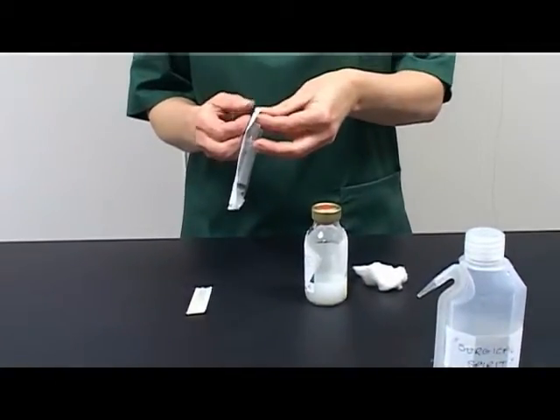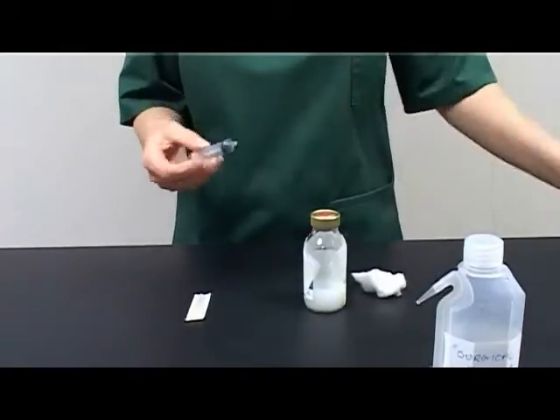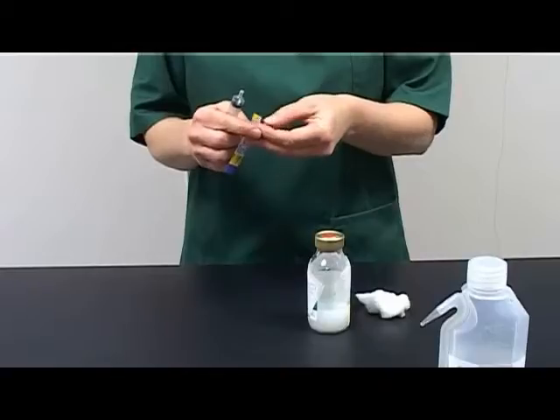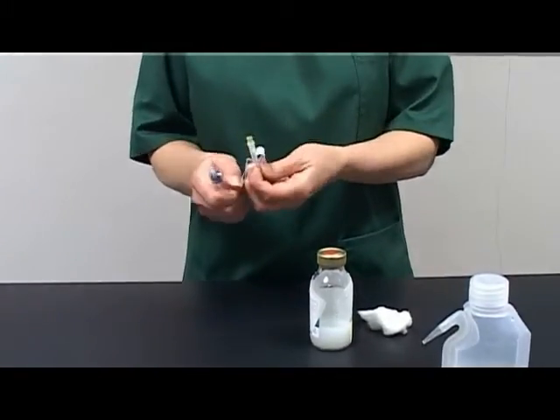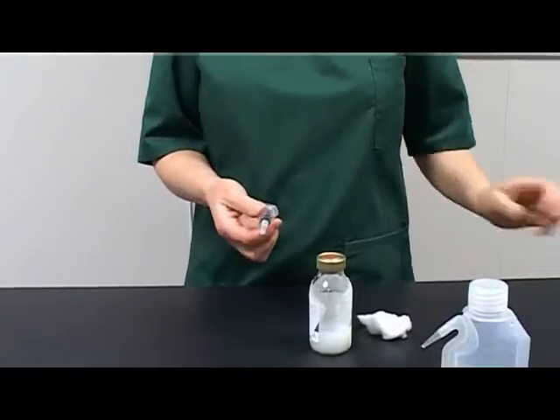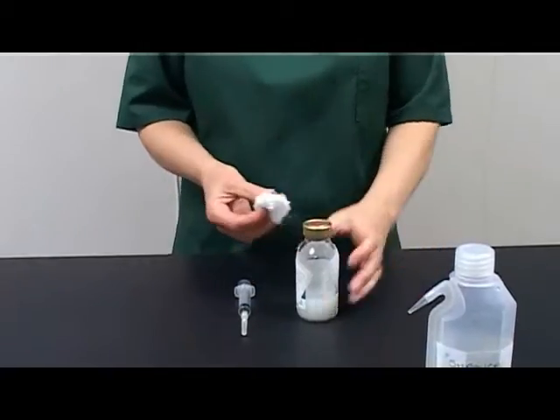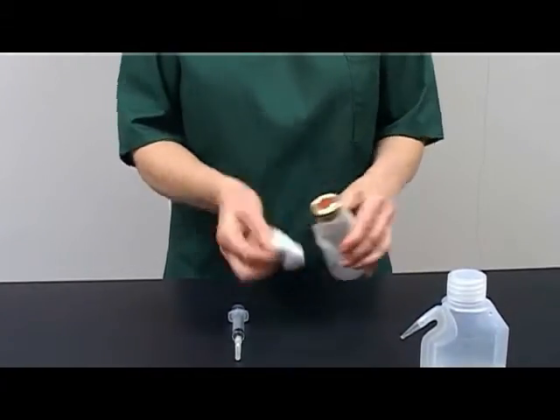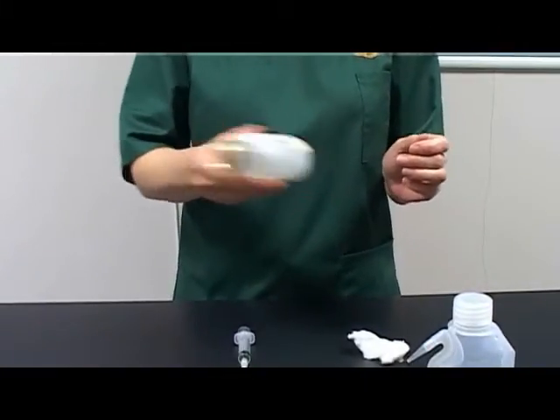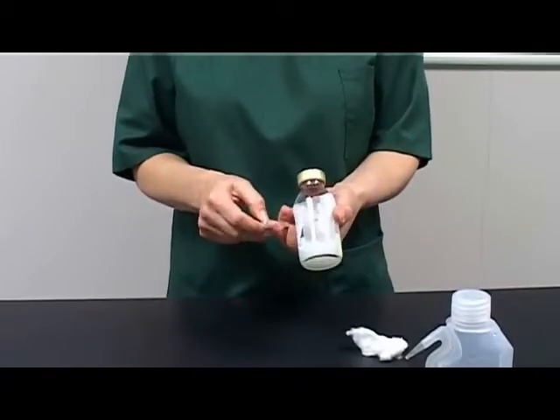Assemble the syringe and needle aseptically. Swab the top of the vial. Shake the vial to re-suspend the drug. Introduce the needle to the vial aseptically.